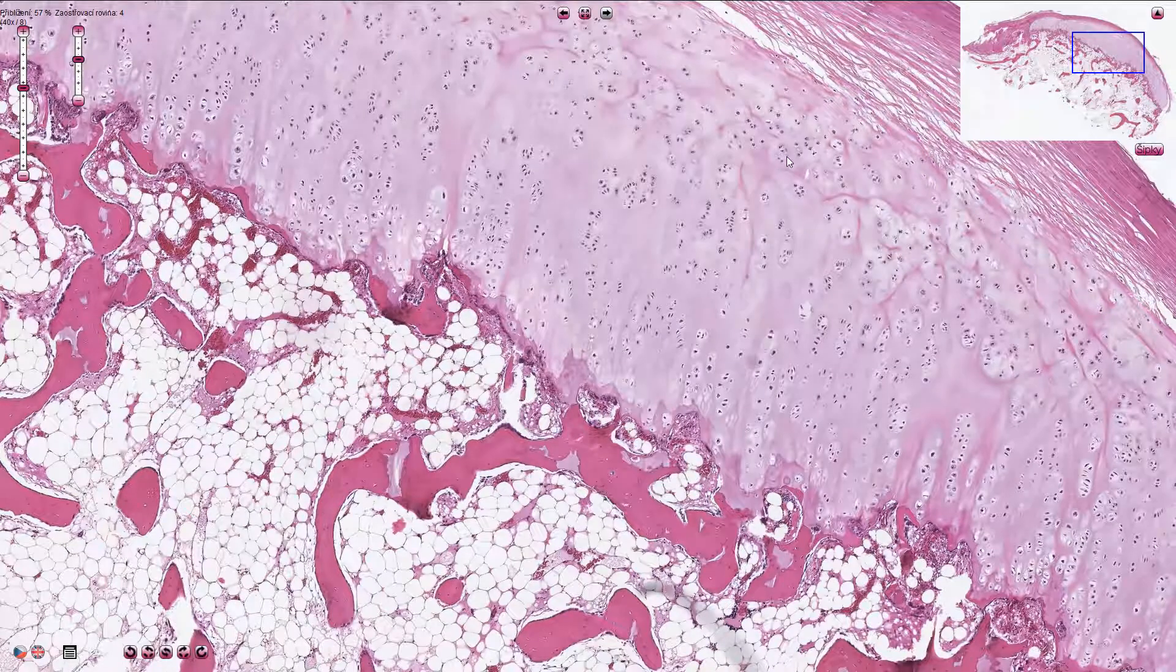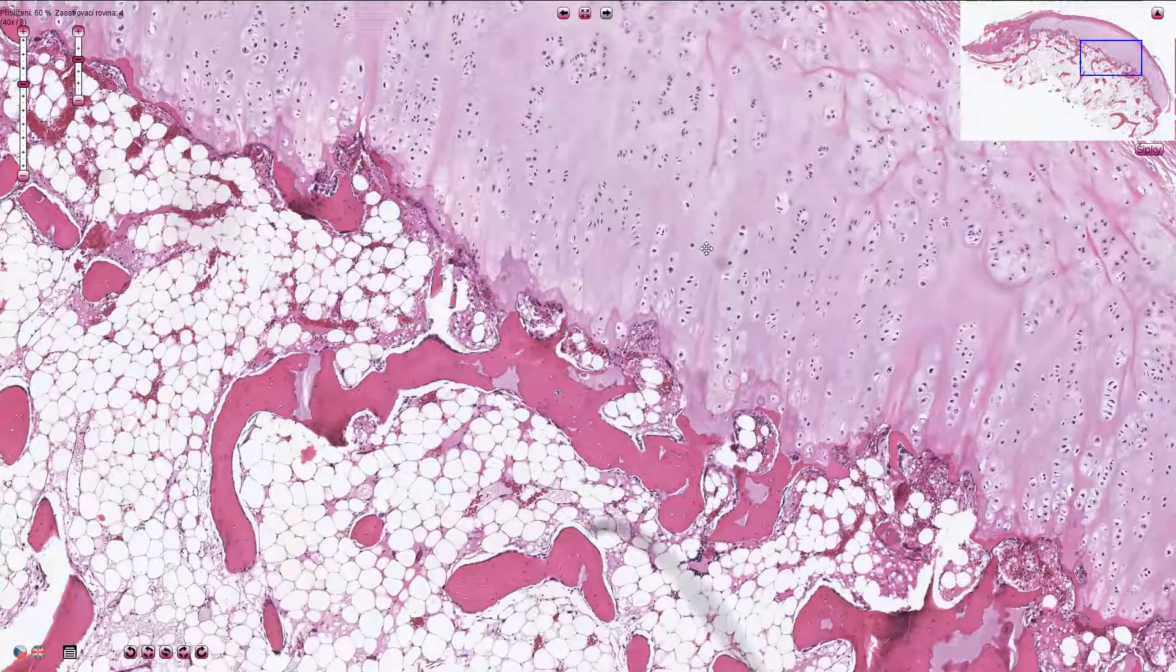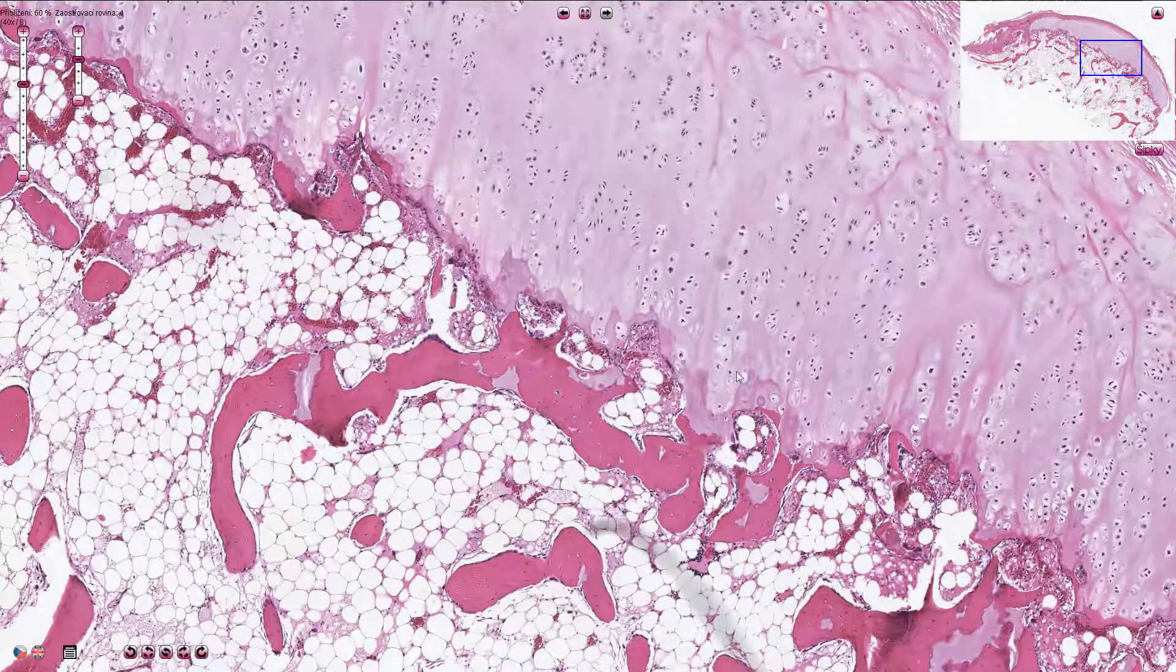So here we have quite small inconspicuous chondrocytes, and here we have slightly larger chondrocytes arranged in columns.